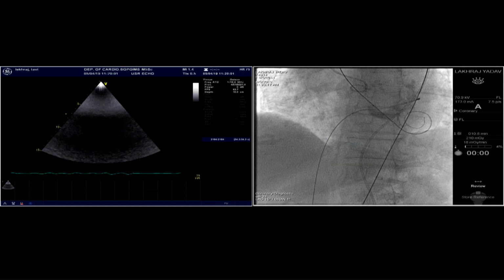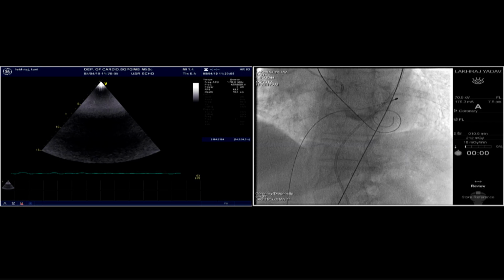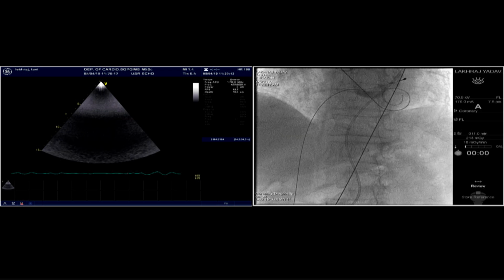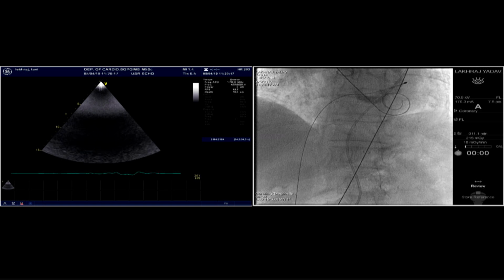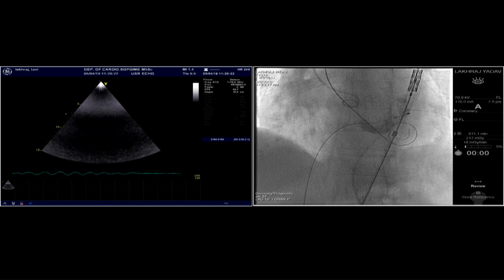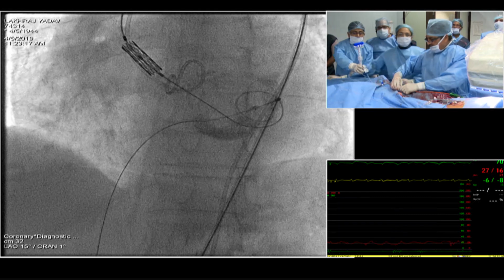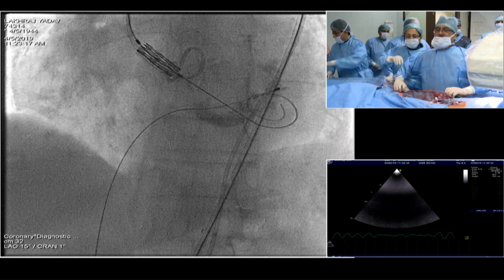Wire fixed. The second possibility is the wire is pinning open an aortic leaflet or even caught up in the mitral valve apparatus. Wire fixed. Yeah. So that's going through the sheath. That's the valve going up. NORAD, everything you push. Give a bolus of adrenaline. What is the pressure like? Give 1 ml.